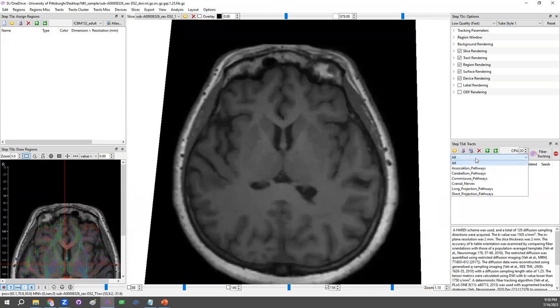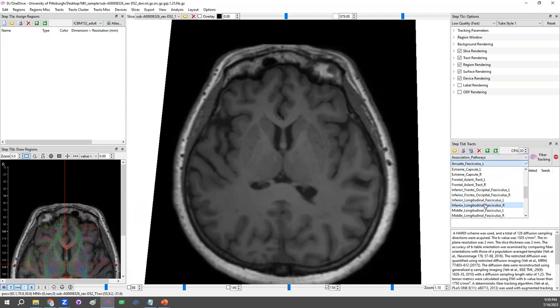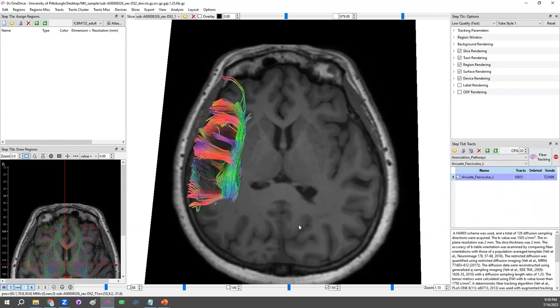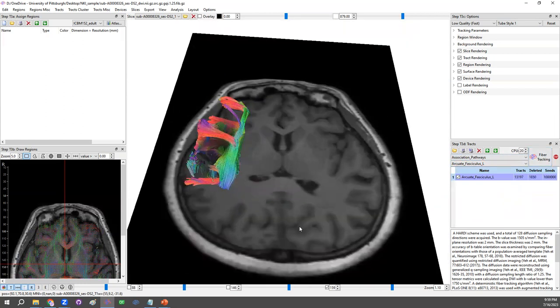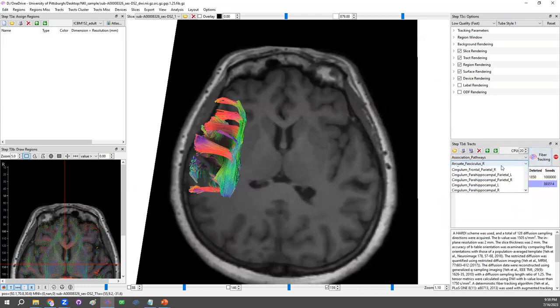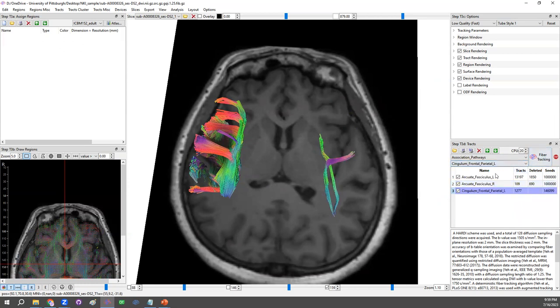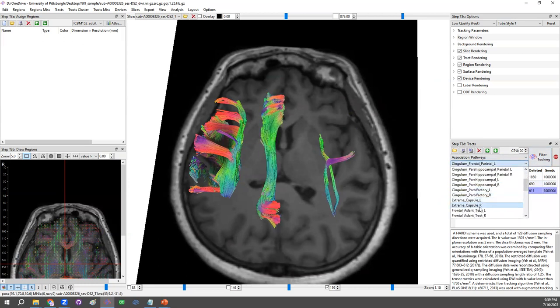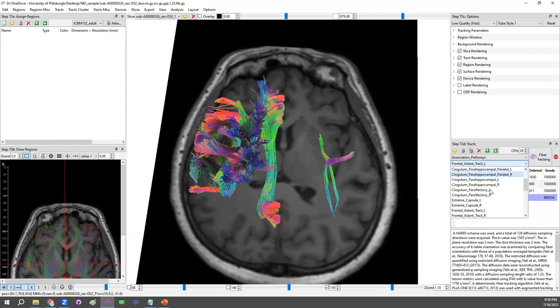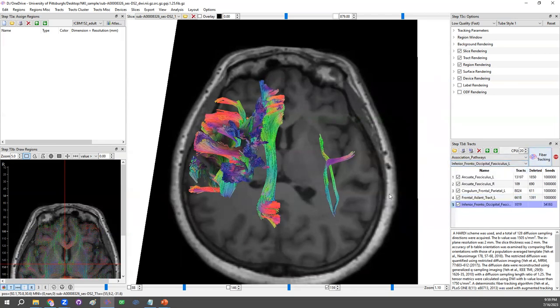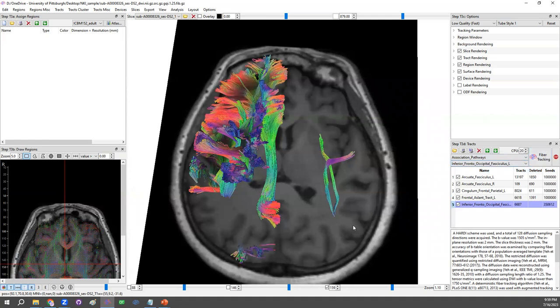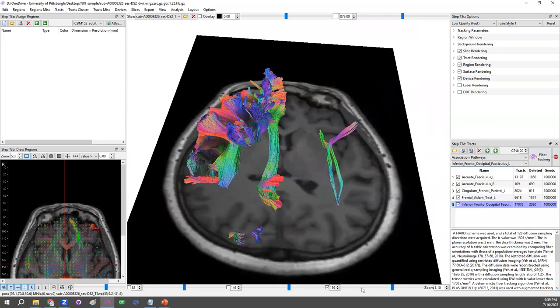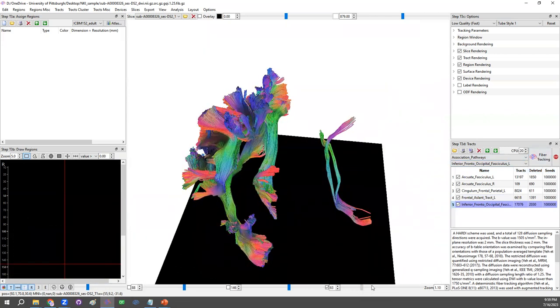So create all the whole brain tracks. Now we could say, okay, I want to map association pathway. Under the association pathway, there are also different pathways available. For example, there are arcuate fasciculus. Once we set up target pathway, we could run fiber tracking. You see here DSI Studio start mapping those pathways. And of course, you could map the other side. We could map cingulum. So there are lists of pathways available. Then we could just go ahead and then click on it and map it here. So within a few seconds, this automatic fiber tracking is already mapping some pathways. And visualize here.